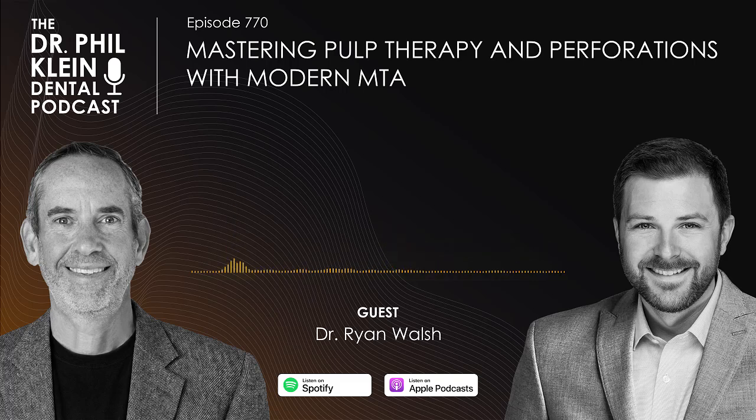Yeah, I don't see any need to have to wait that long, especially with some of the quicker setting materials we have these days, like MTA VPT from Voco. I mean, it sets so quick that you can place that material and confidently restore right over top, and then continue to evaluate the tooth. So I always think recalls are important no matter what you're doing with pulp tissue, as far as if it's a mechanical exposure, if you're doing a pulpotomy, partial or full. But I think follow-ups, 1 month, 2 month, 3 month are really important. But I don't see any need to delay that permanent restoration.